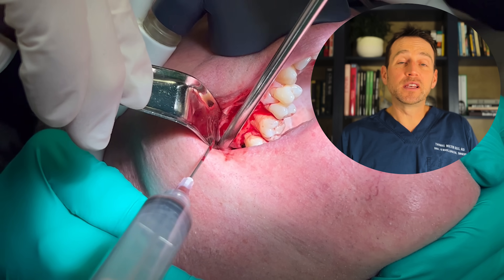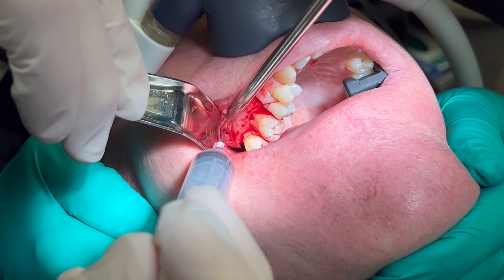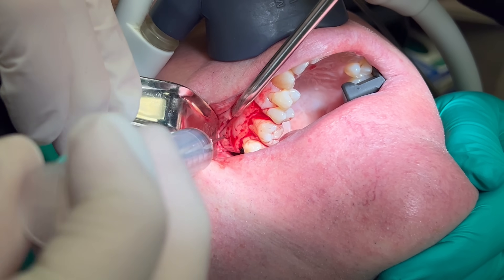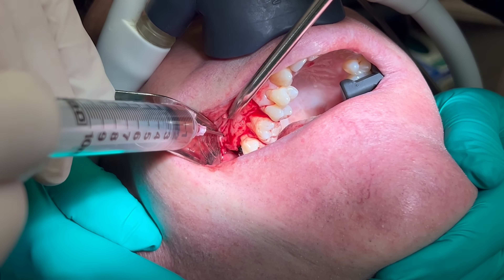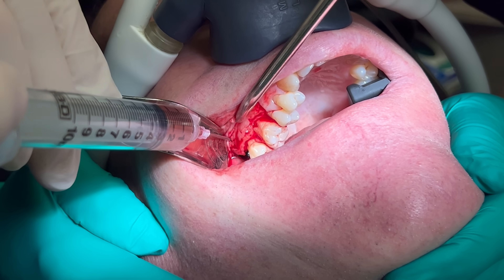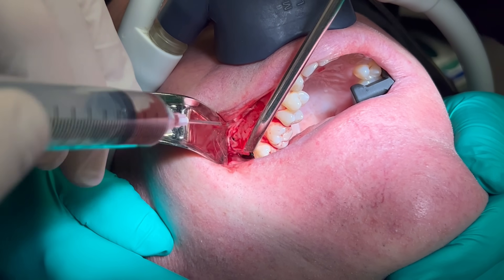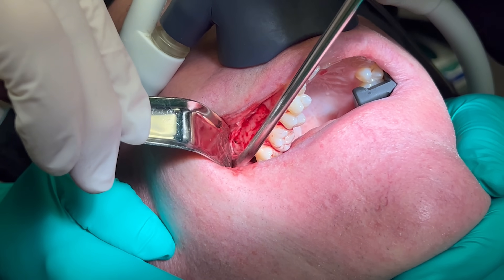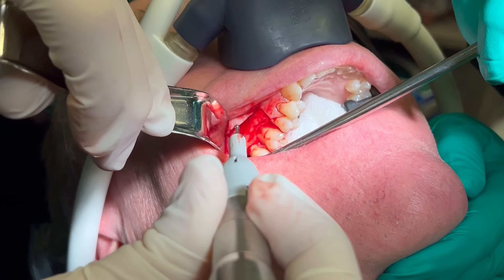I aspirate the contents of this lesion. I then make a bony window to gain access to the sinus.